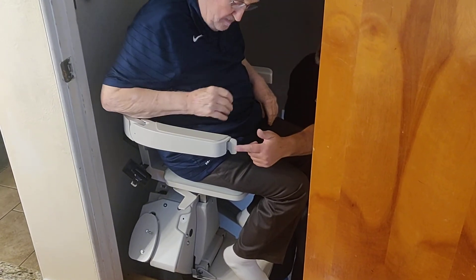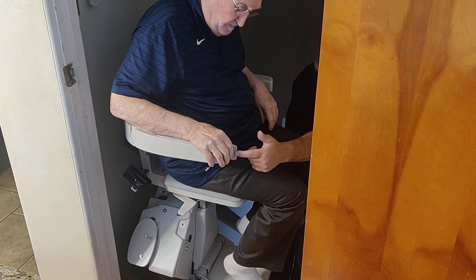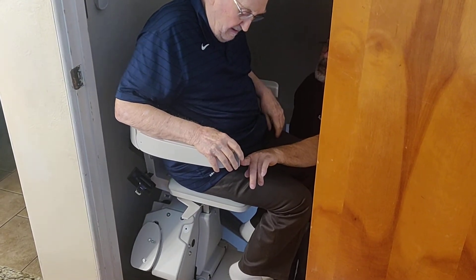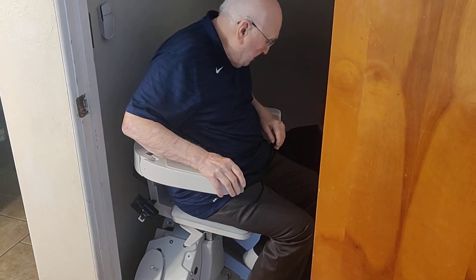Right here — here's your lever. Everything on this is constant pressure. So if I push, you go down. This way is up. And when I let go, it stops. When you let go, it stops.